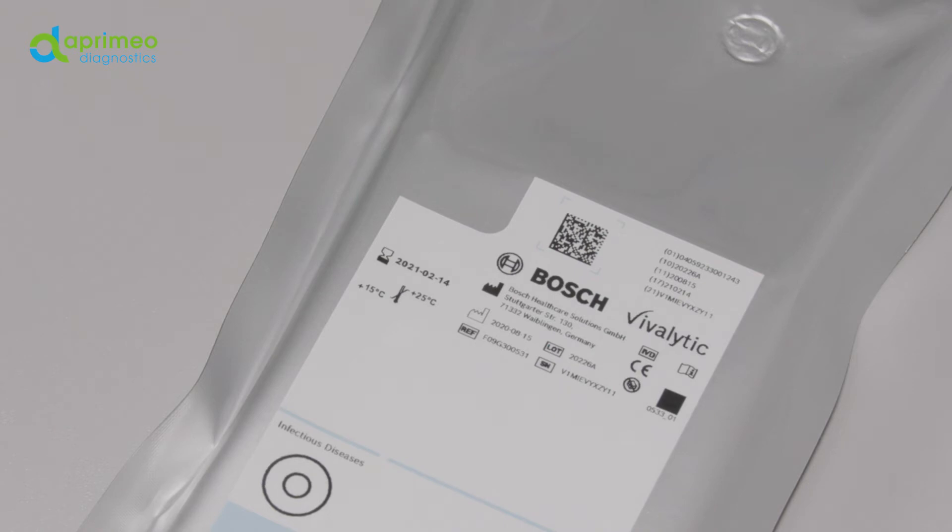Next, please check that the shelf life date of your cartridge is still current. Expired cartridges will not be accepted by the system.